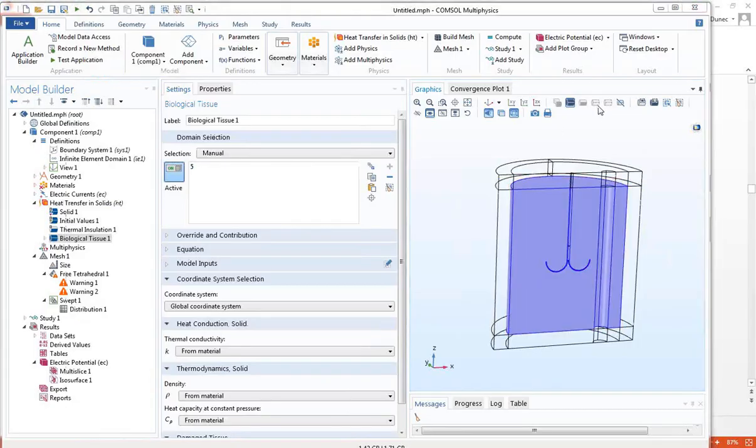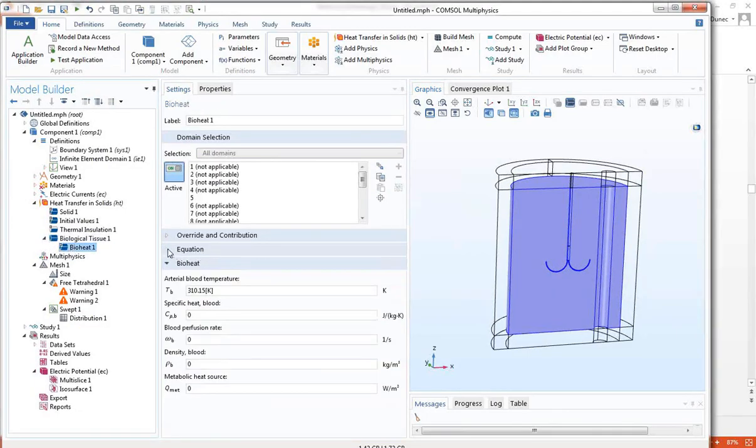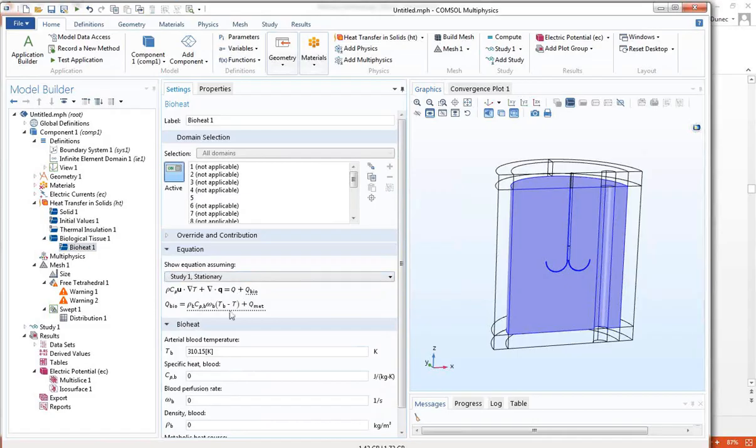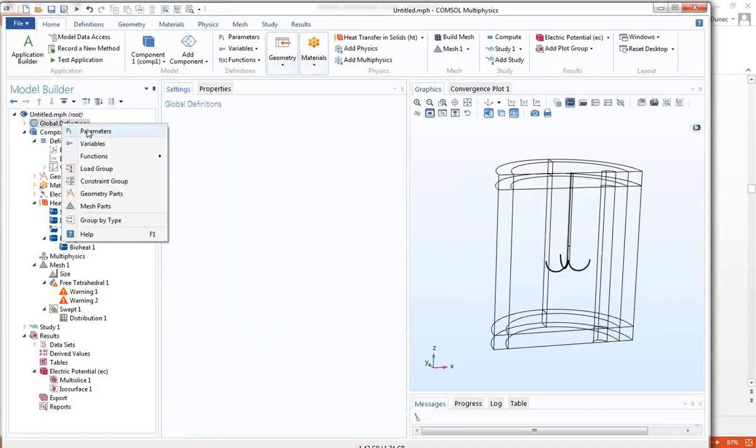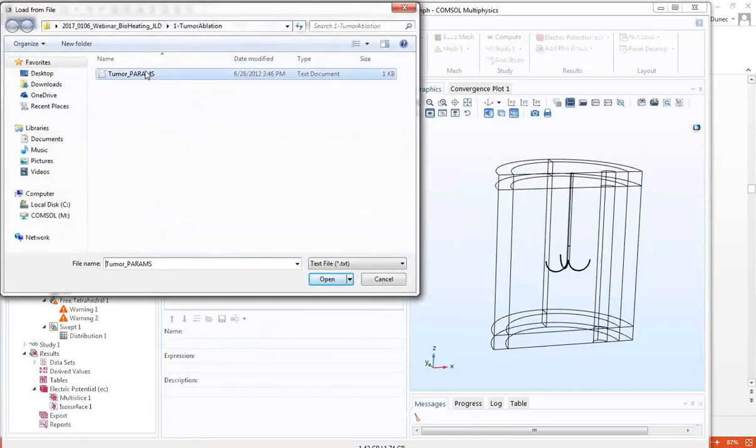What is a biological tissue to us? It's places that have capillarization. So the capillarization follows the Pennes equation, where we are simulating the capillaries as a distributed heat sink or source. So it needs some material properties. So I'll go in and I'll add that. I'll do that through parameters. And I will read those parameters from a file. I already typed them in.